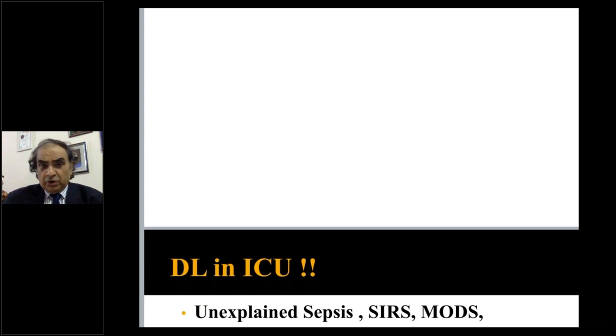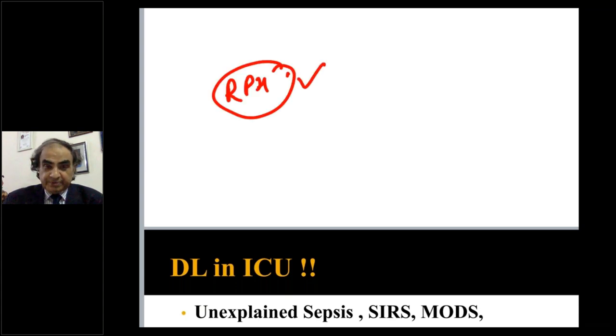And it'll also have a role, according to me, in seeing the expansion of a retroperitoneal hematoma. It's an important point. If it's not expanding, no retroperitoneal hematoma, which is non-expanding, and naturally I'm doing diagnostic laparoscopy. What does it mean? Hemodynamically, the patient is stable. So you can amount to calling it fiddling with nature.